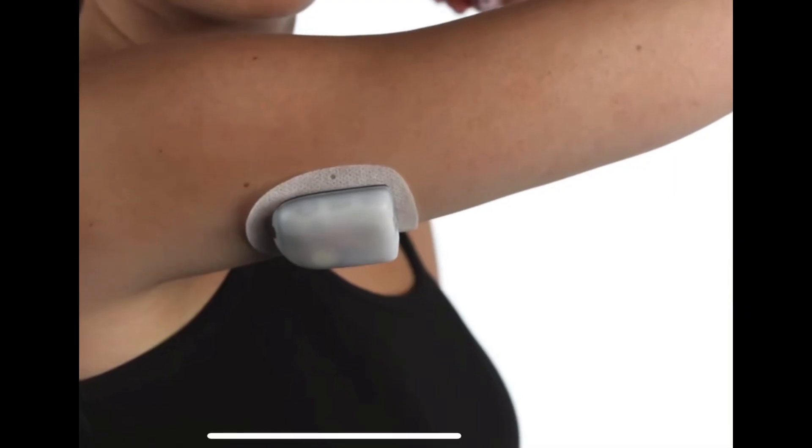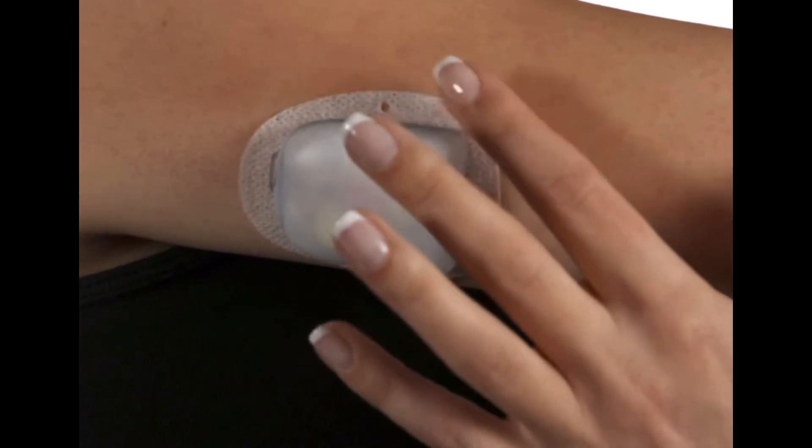The algorithm is actually built into the pod itself, not just the phone. So if you walk out the door without your smartphone or forget your controller, the automatic basal adjustment will continue to work. You don't have to worry about your phone controlling the basal rate — it's automatically done through the pod. This is great for when you exercise and don't want to bring anything extra with you.